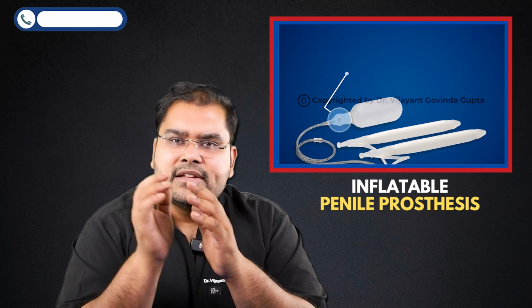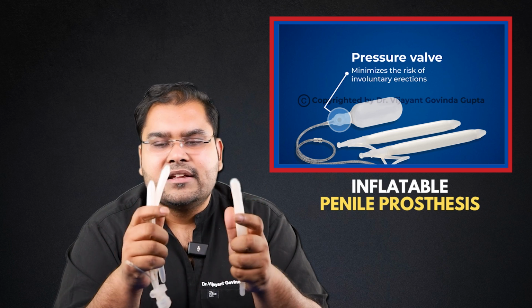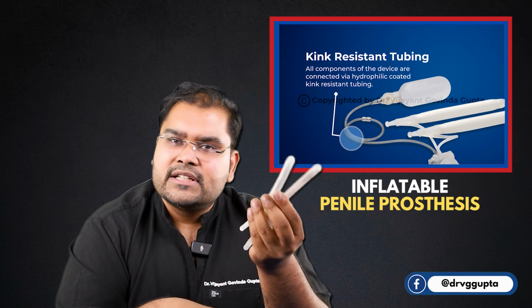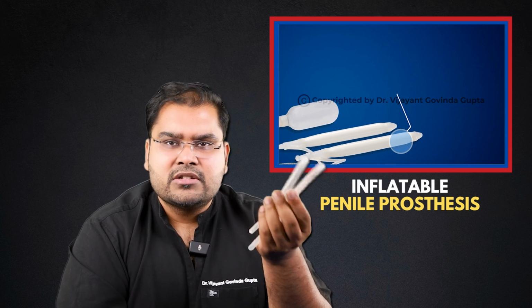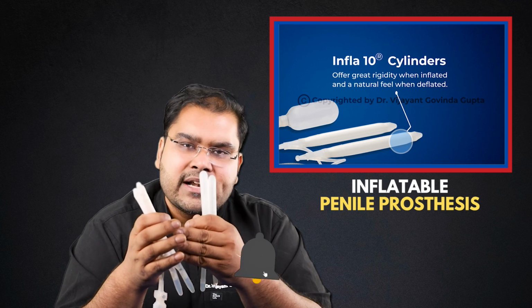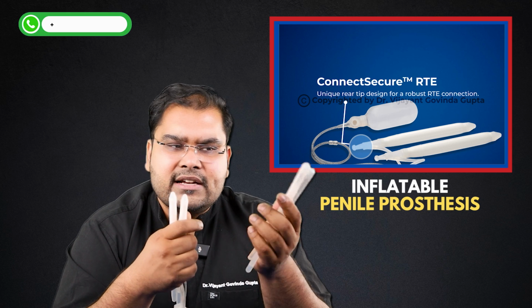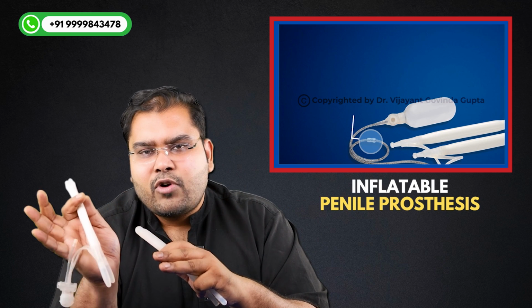Now compared on hardness, if your target is not concealability, if hiding the implant is not important, if what you're looking at is size, if what you're looking at is hardness, the punch, then obviously the Indian implant is going to be harder because it's solid. Because it's solid silicone, obviously silicone is always going to be harder than water. So if you look at the hardness scores, the Indian implant scores better over the three-piece. So patients with the Indian implant have harder, stronger erections, it feels firmer, and definitely it is going to be much more pleasurable for the women as compared to the water-filled implants.